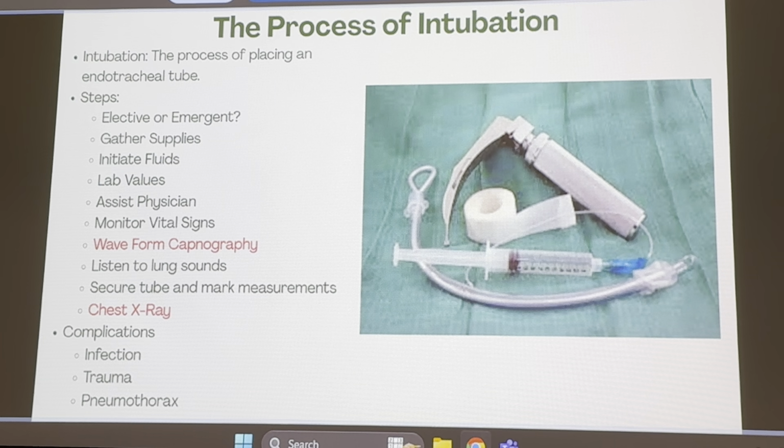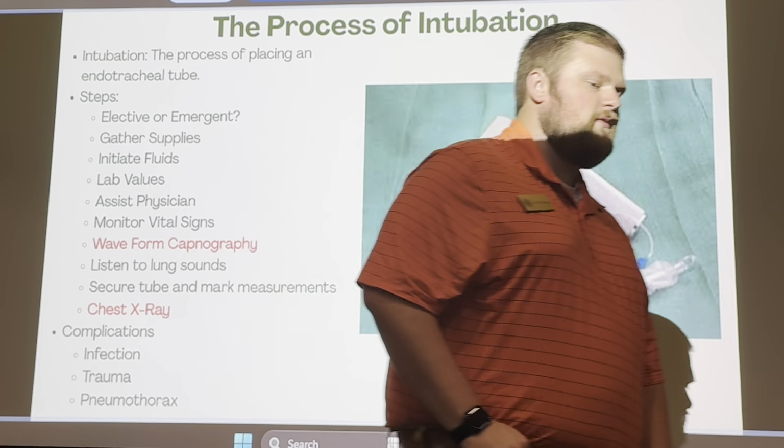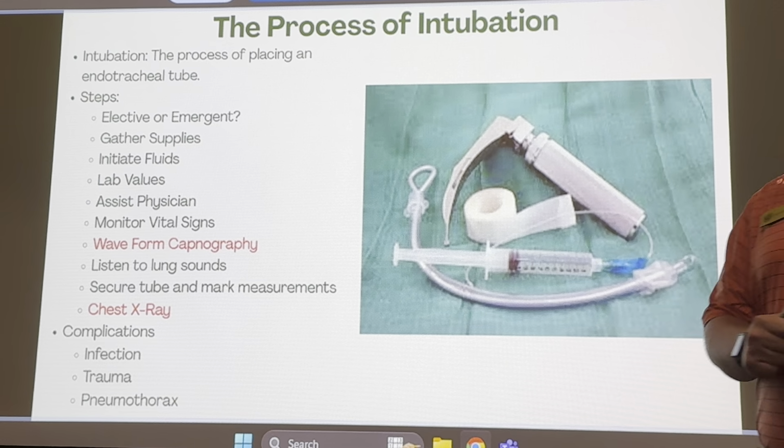And a bag-valve mask? Yeah, that's good. We're giving them all these drugs, and we'll talk about them in just a second. We probably need to help them with their airway until we establish an artificial airway. How's that physician going to put that thing in and open up that airway? Laryngoscope, more than likely, yes.